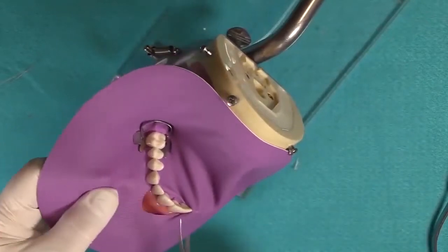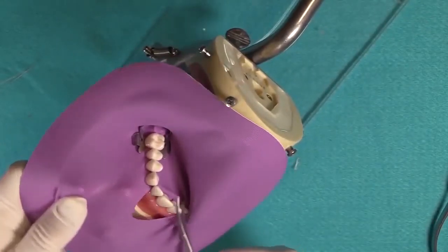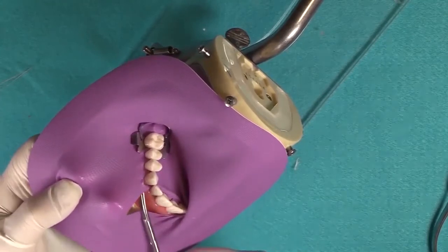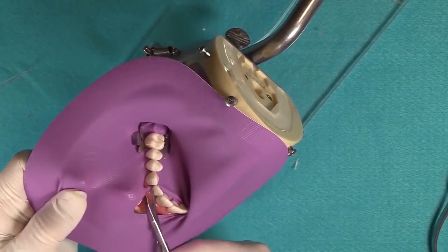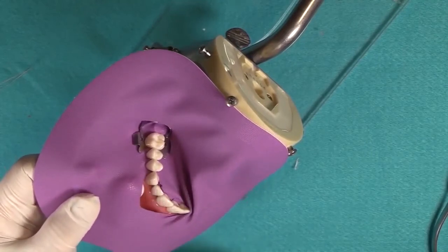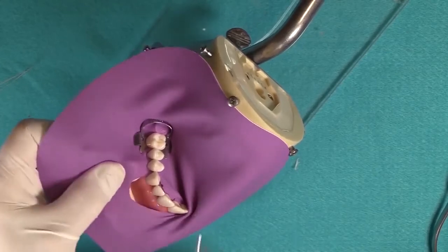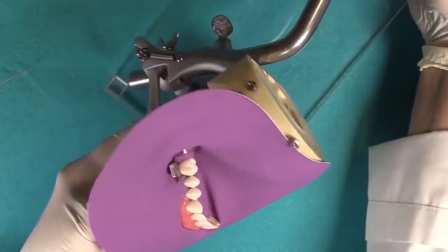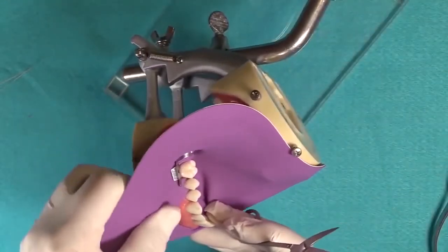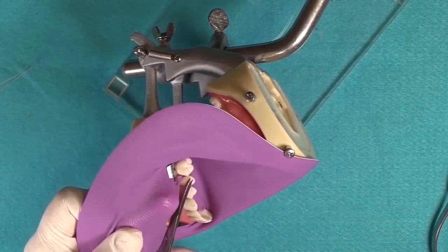Because let me see if I can demonstrate what can happen. If you don't, you can see what will happen. You can get a little ring of rubber around the necks of the teeth. And if that remains, that ring of rubber will migrate to the apex, and it'll actually cause the tooth to avulse. So rather than just pulling it up through, you're pulling the dam away, and then your scissor is cutting here.